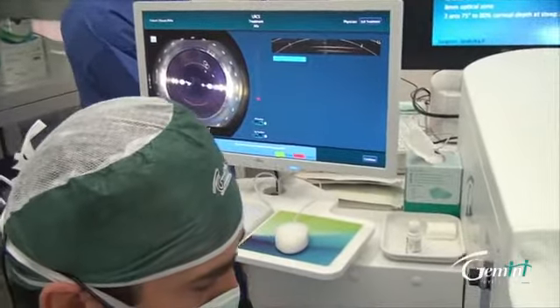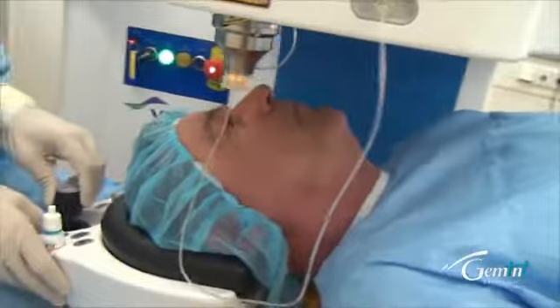And everything is ready for the second part of the surgery. Did you have any pain?